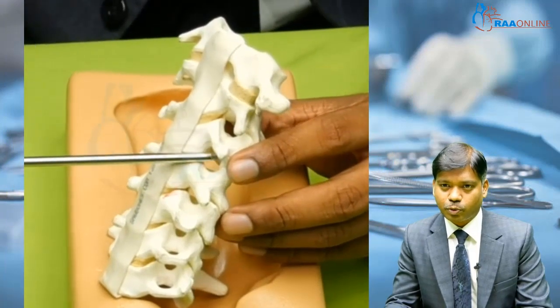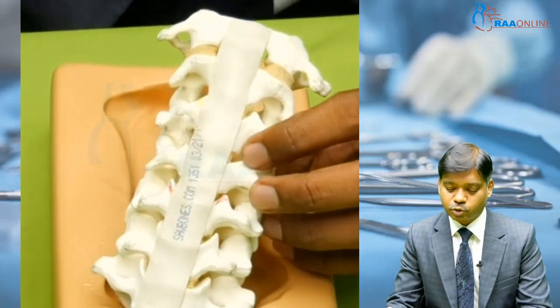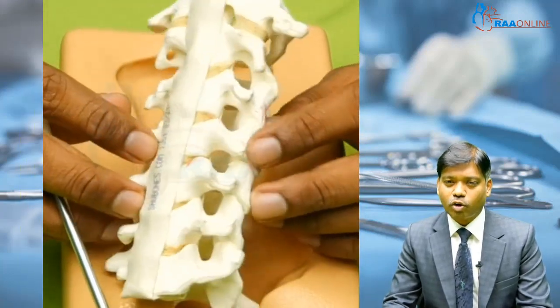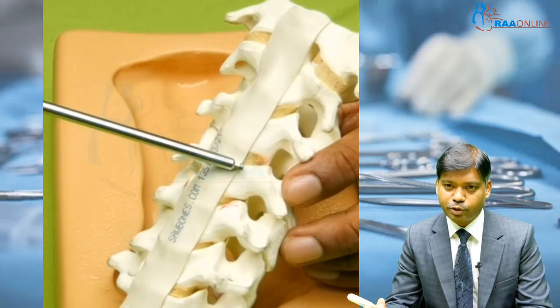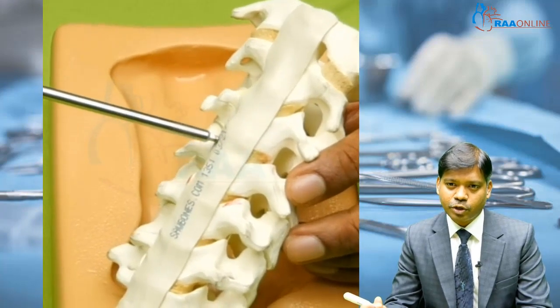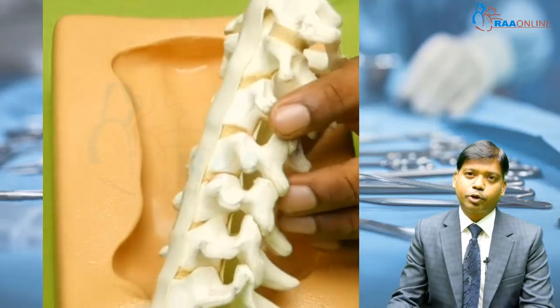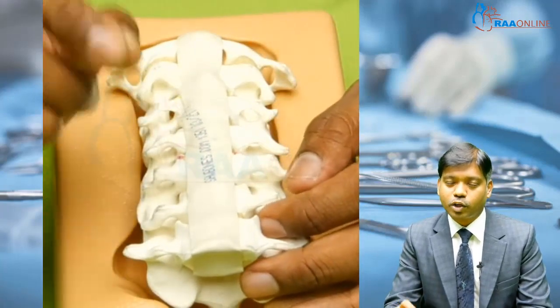Whenever there is a disc prolapse and it is pressing the nerve, the current gold standard treatment for disc prolapse which is not getting better with conservative treatment, or with neurological deficit, is anterior cervical discectomy and fusion, wherein you remove the entire disc. You remove this disc, you remove the posterior longitudinal ligament, and you remove the prolapsed fragment which is causing compression on the nerve root or on the cord.